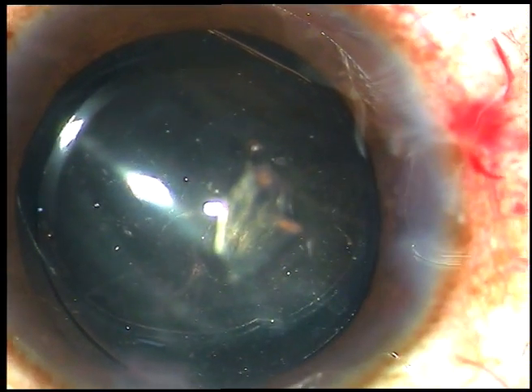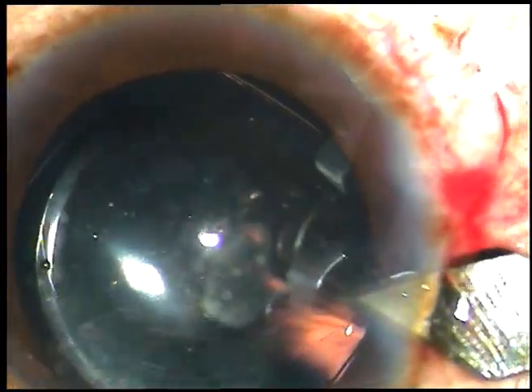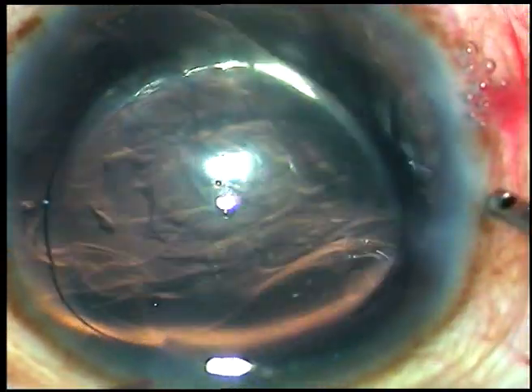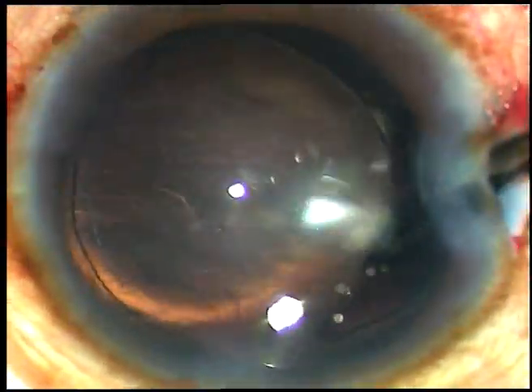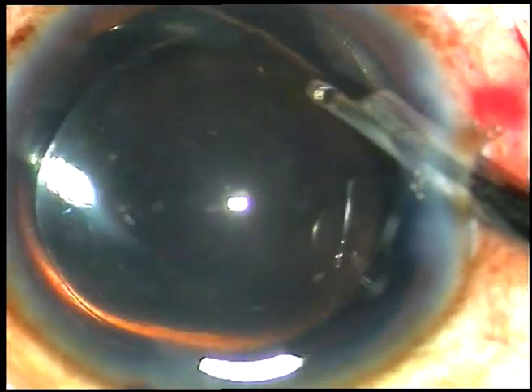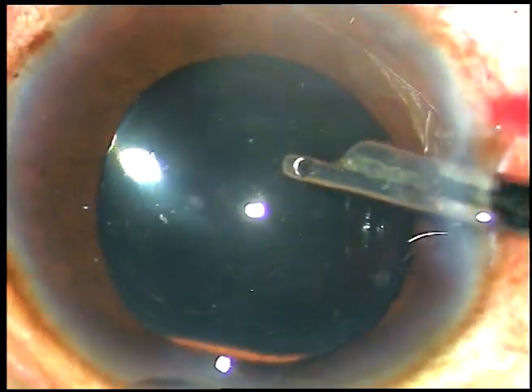A lot of visco is there in the capsular bag that must be cleaned out. This is enlargement of the main incision to about 3.5 to 4 millimeters because there is a lot of astigmatism — astigmatism is 4.34 diopters. The epinucleus that was sticking to the corneal endothelium has come out; I irrigated some BSS towards the epinuclear piece, it got dislodged and came out.